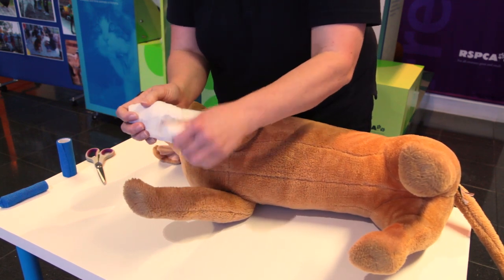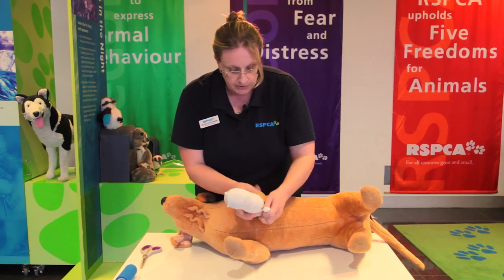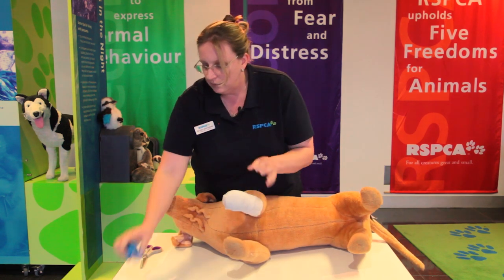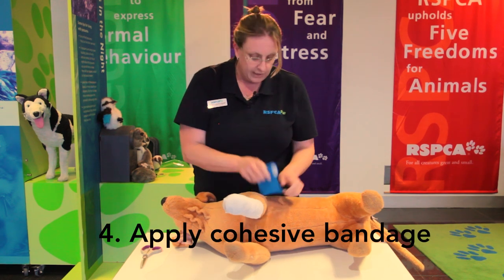Once we have an even coverage of the paw, again with the barrel up so we can control the tension, we open the weave, make sure there's a little bit of pressure on there, and cover the underlying layer completely. Then we have what we call a cohesive bandage rather than an adhesive bandage — it sticks to itself but not to the dog's hair.